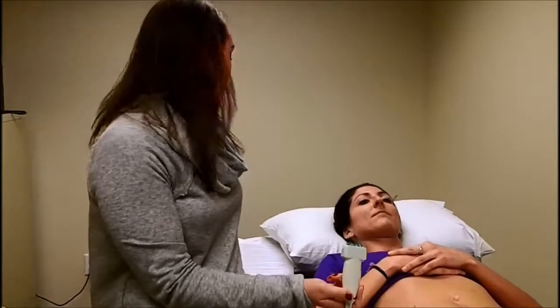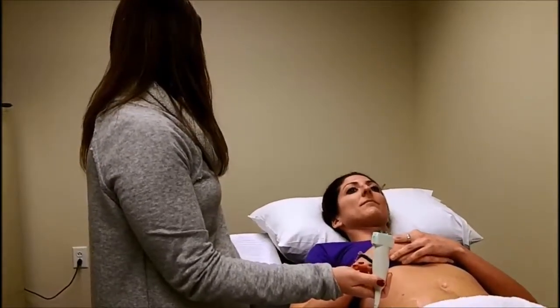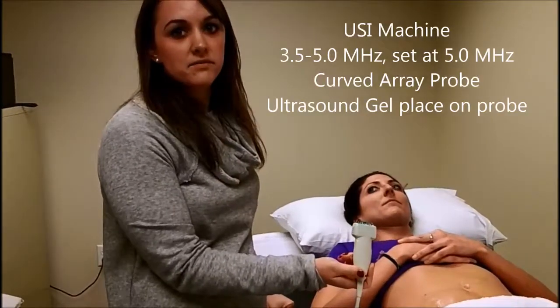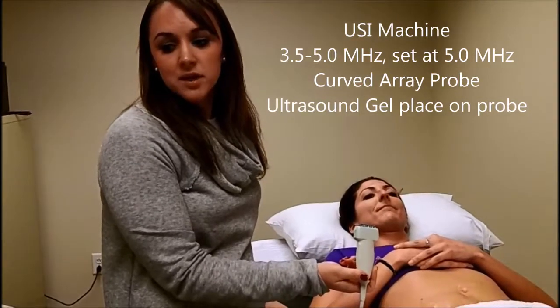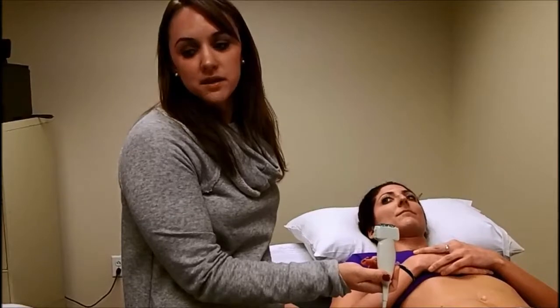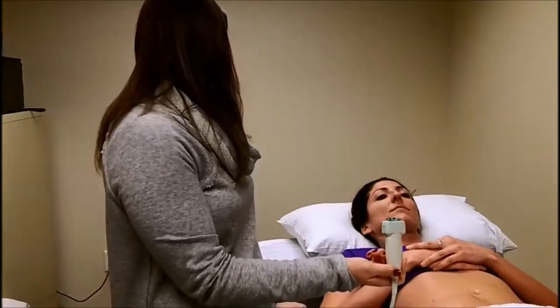It was a single-patient case study examining postpartum low back pain, using an ultrasound imaging machine that operated from 3.5 to 5 megahertz. Ultrasound machines vary based on their frequency level, which affects how deep into the muscle you can see.